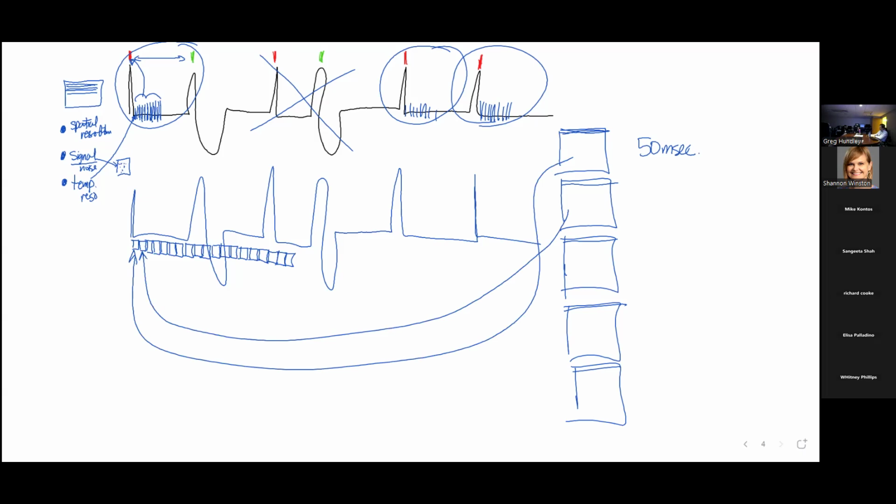Now, why don't we do that all the time? Because in order to keep this, we are going to have to sacrifice this and this. So can we do it? Yeah. Is it going to have these brilliant, bright images? Well, actually, the scanners have gotten pretty sophisticated and they don't look that bad.